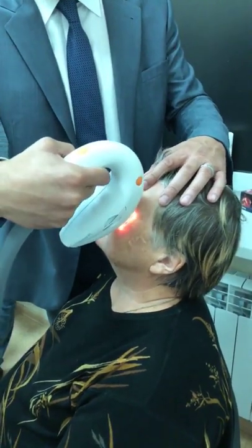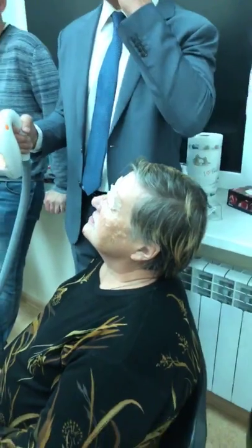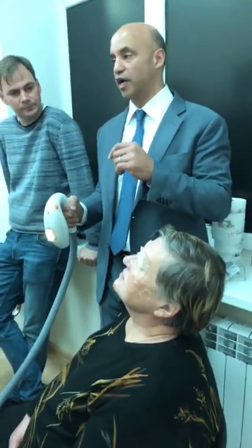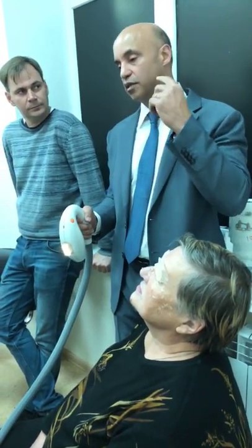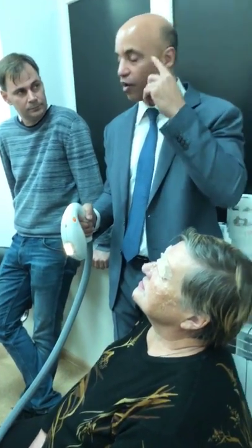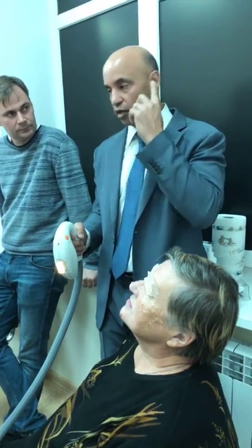Right there on the eyelash margin, right there. And then what we found, going ear to ear is the best treatment. We tried everything. We tried just the lids, we tried full face, we tried ear to ear and then above the eyebrow. But the best results were 2 passes, ear to ear.